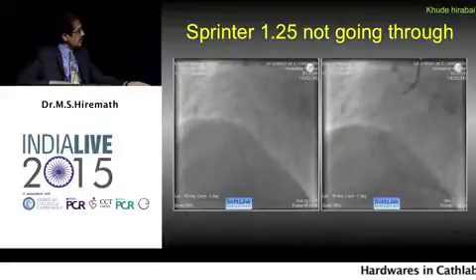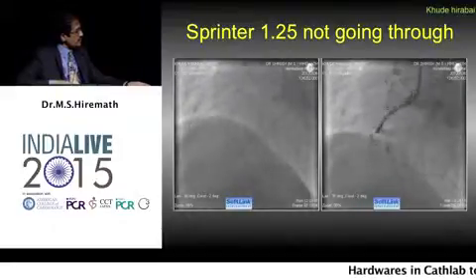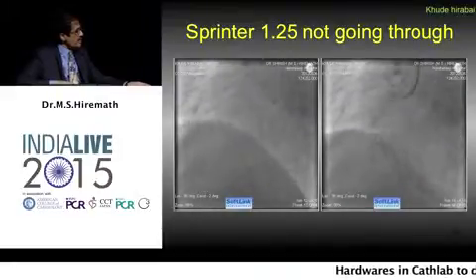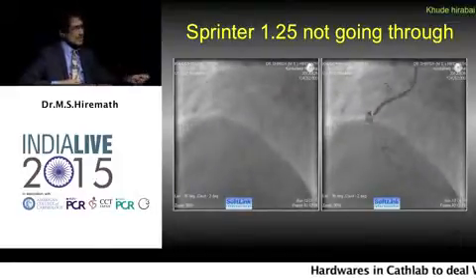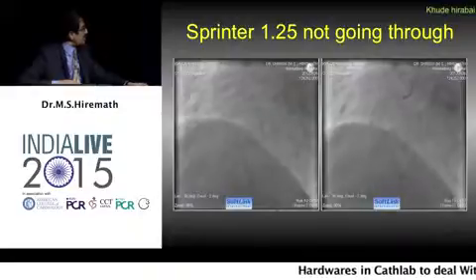The stent tracked through this position of the guide catheter very easily. So with the guide catheter, you could take it down, and thus you can achieve a lot of safety.